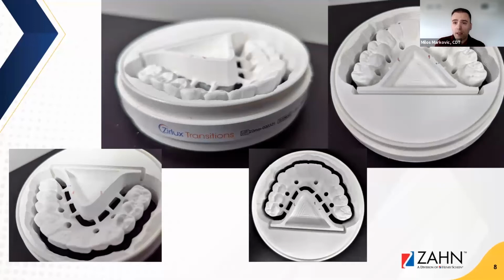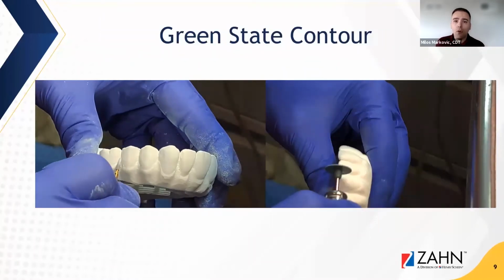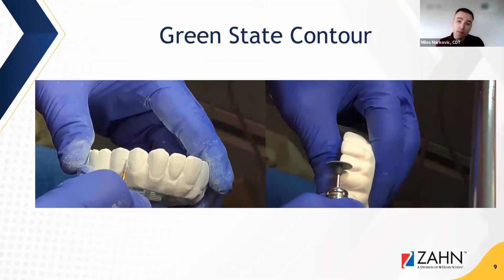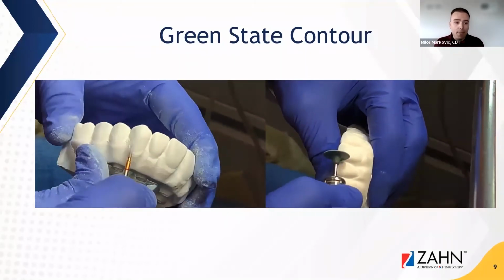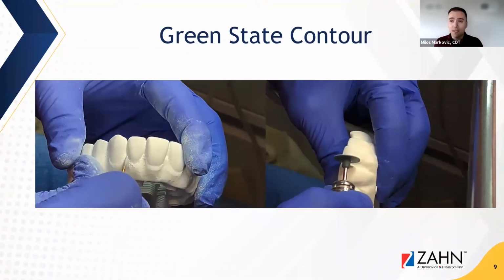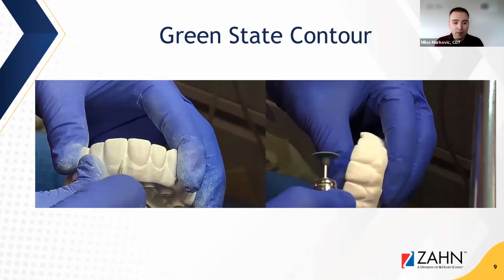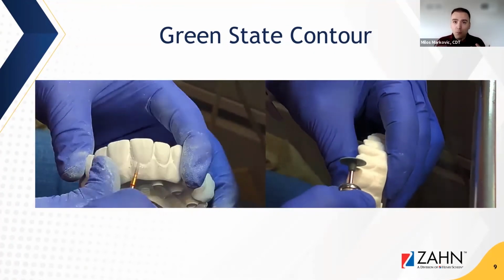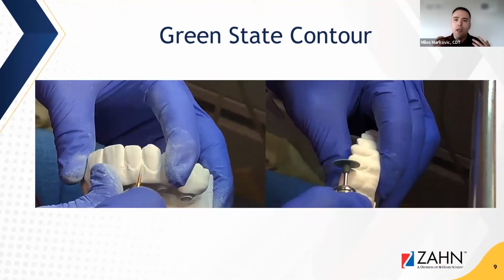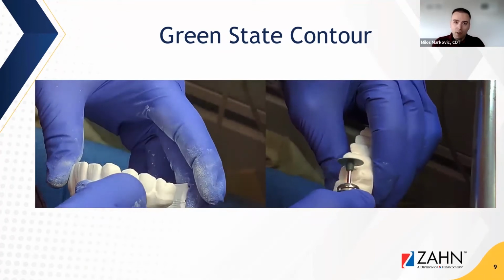Then we go ahead and obviously have a case that's been milled. We take it out, we analyze it, and after we cut it out, here you can see an example of green state finishing. As I'm sure many of you know, green state finishing is really the way to go. We've cut down sintered zirconia finishing in totality here at Aurora, because we can see that our ceramists can really put a lot of their detail and contouring and individualization in their materials in green state.